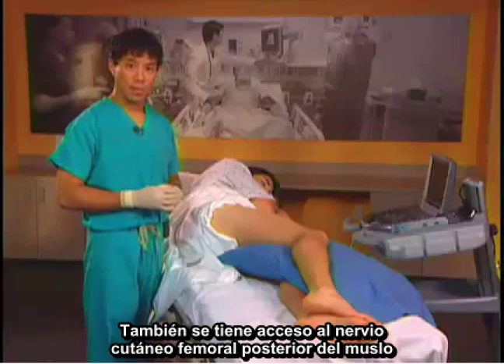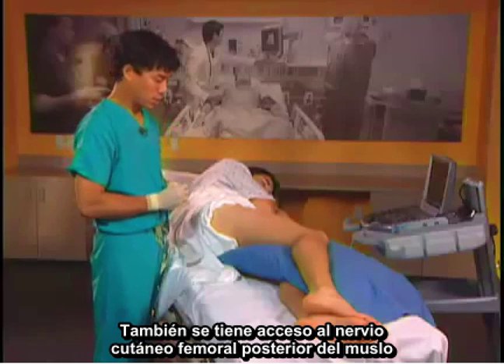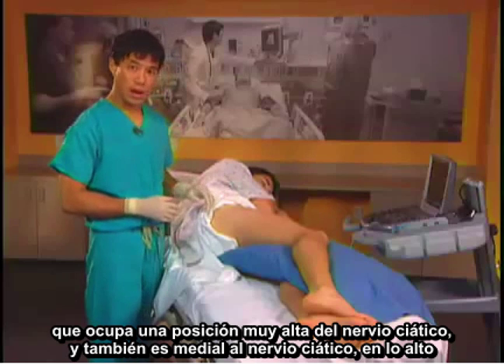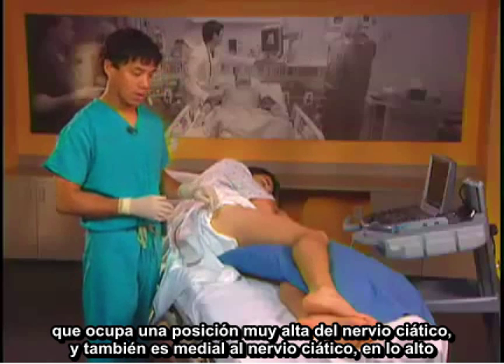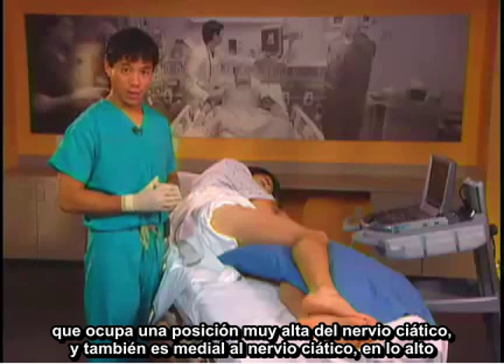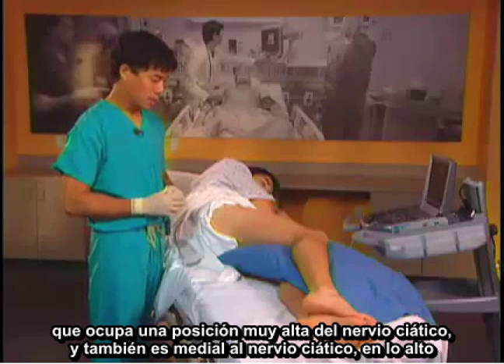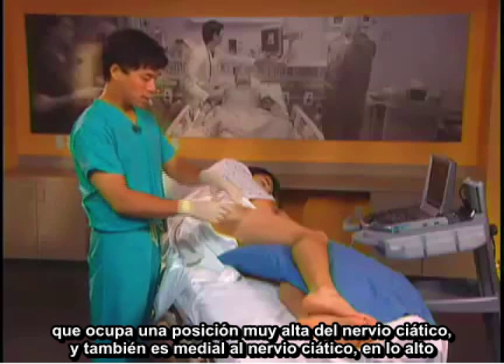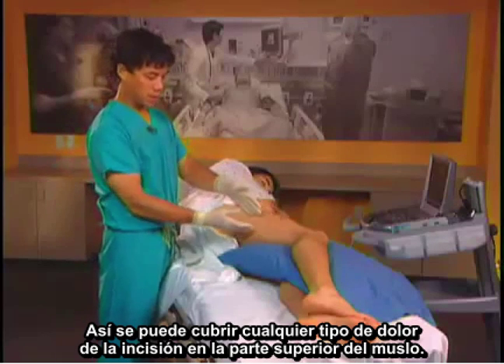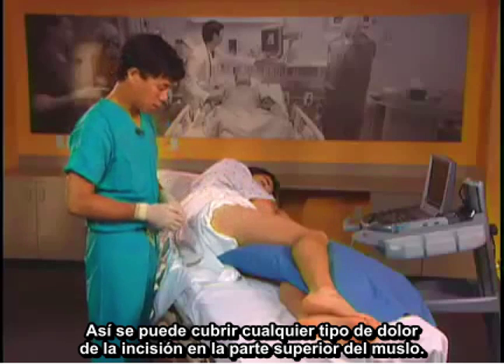You may also get the posterior femoral cutaneous nerve of the thigh, which comes off very high on the sciatic nerve and is also medial to the sciatic nerve as well, high up. This way you can cover any kind of pain of incision in the upper thigh area.